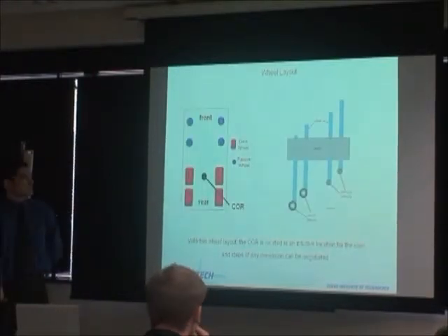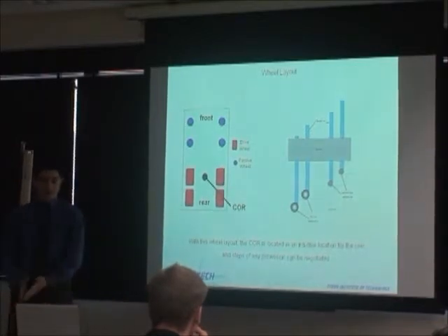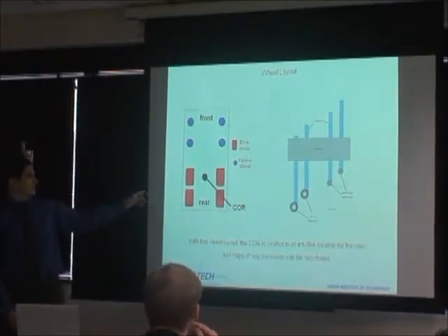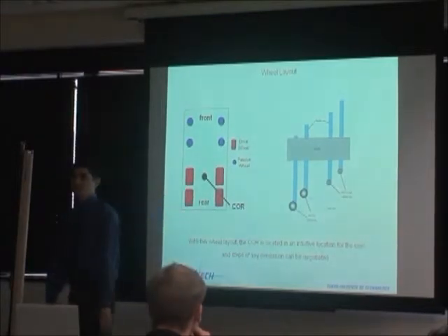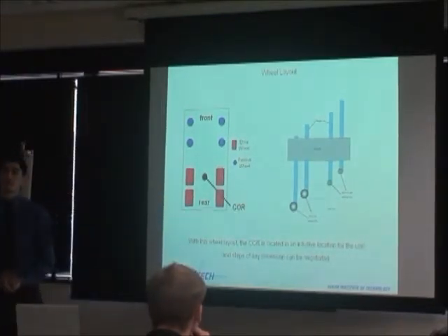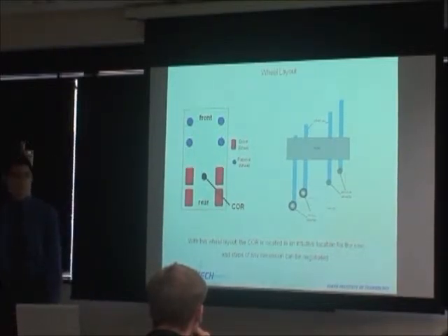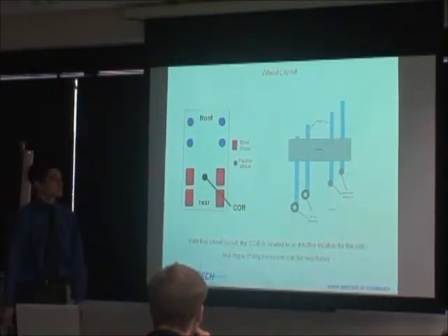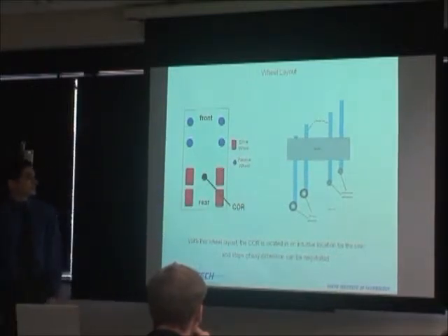So, the drive wheels are located here in the very rear of the vehicle. With all of the drive wheels in the rear, we can ensure that at least one pair of drive wheels is always in contact with the stair surfaces, even as it climbs up the stairs. A situation where all drive wheels have to be raised to climb the stairs doesn't occur with this layout. Also, we have a center of rotation here in the rear of the vehicle.